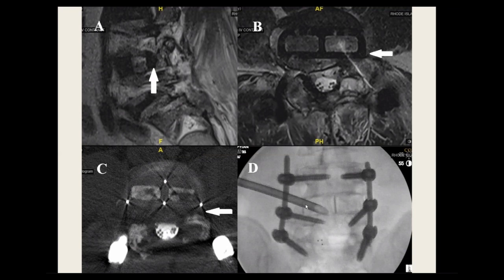So I'm able to introduce the endoscopic tubular retractor here. You can see how far I am past the medial wall of the pedicle, and then back it up, drilling off as much of this cage as possible. And again, the patient had immediate improvement.